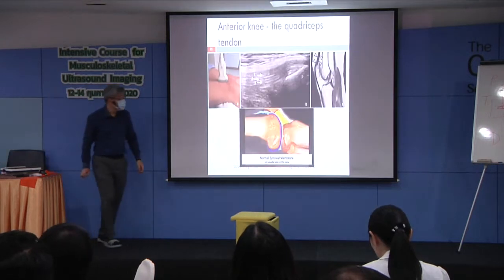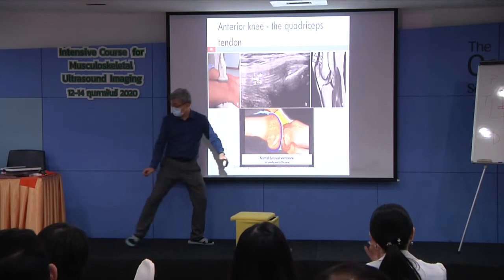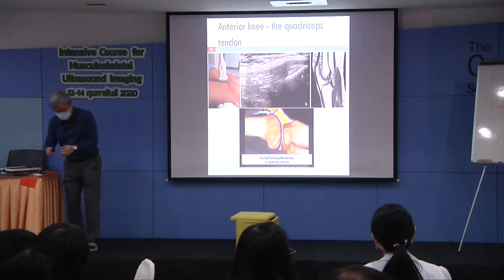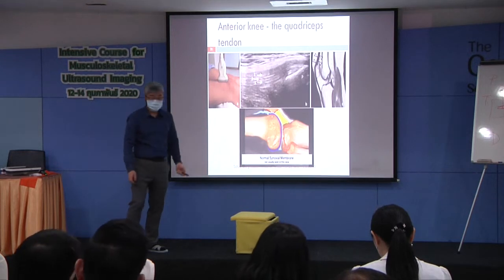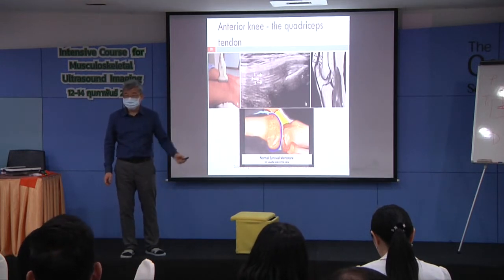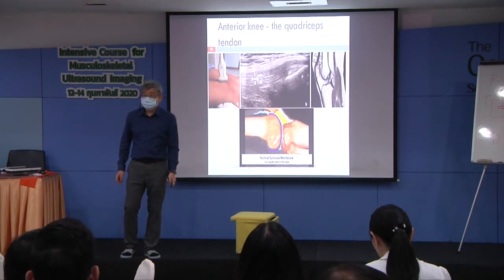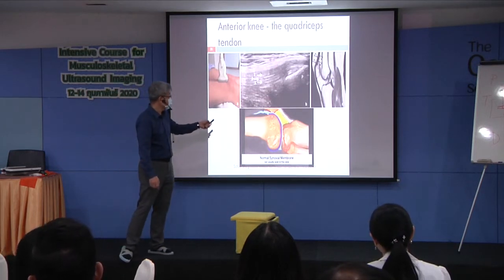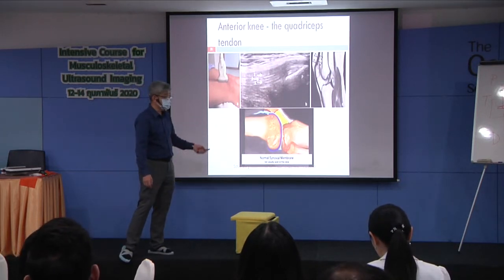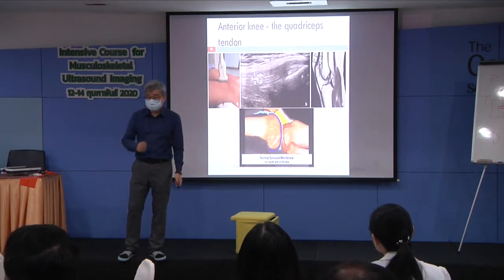For the people who have intratendinous lesions, you are looking for a probe about 12 to 15 megahertz. People often ask me what kind of device I need.